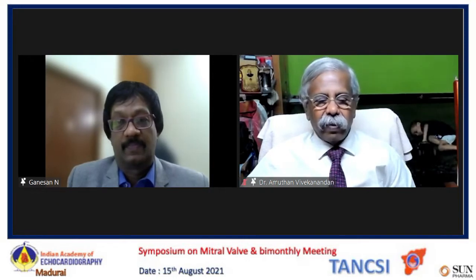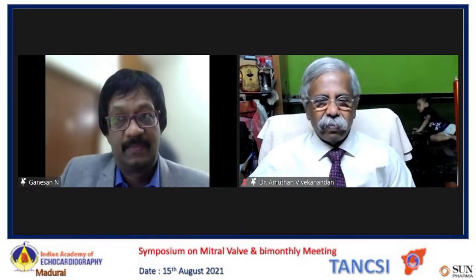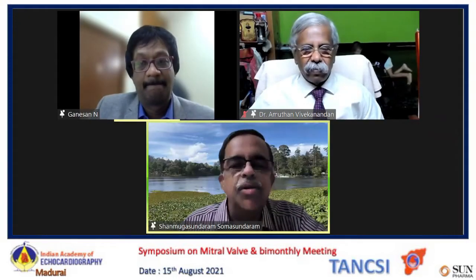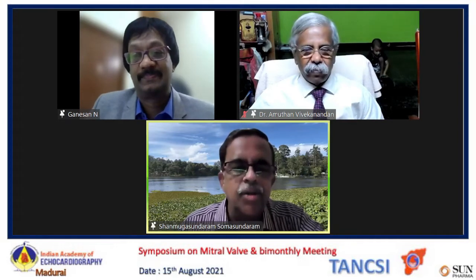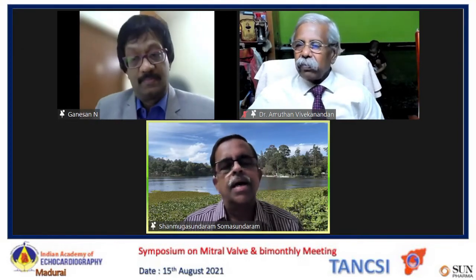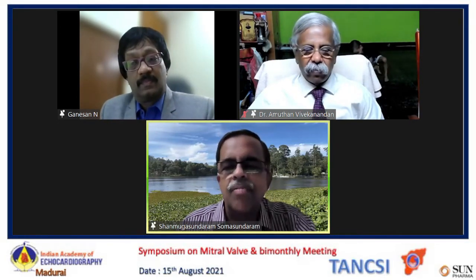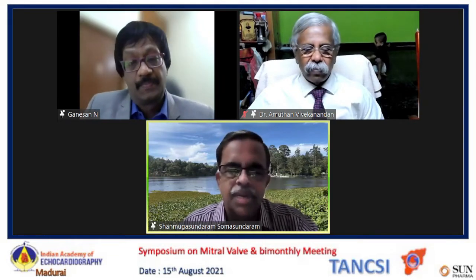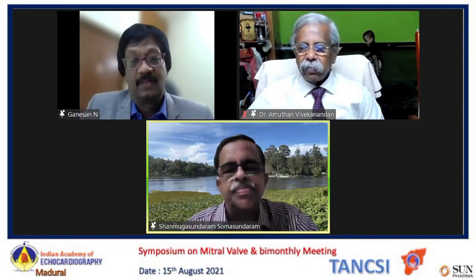Ganesan, it's a very excellent demonstration of papillary muscle rupture. In a very sick individual, getting such a good image is extremely difficult. You've done a very good job. And you have also nicely demonstrated that in somebody in cardiogenic shock and pulmonary edema with a hyperdynamic left ventricle, one should consider papillary muscle rupture. I think we have demonstrated that role very nicely. Thank you very much. Okay, thanks.